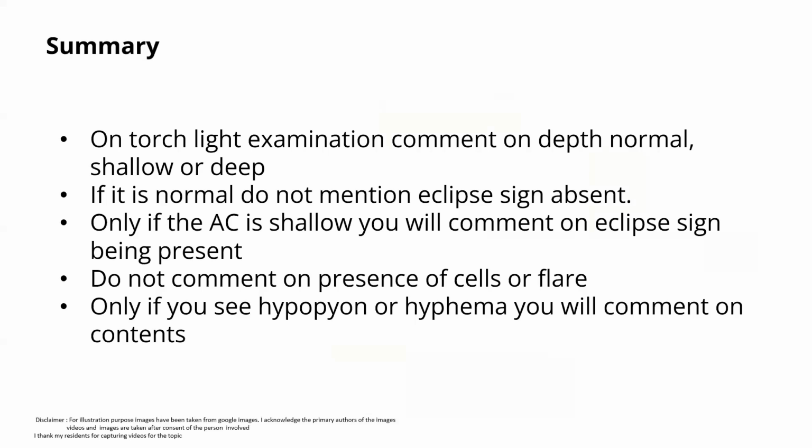Most of the students are in the habit of saying normal depth and no eclipse sign, no hypopyon, no hyphema. So you don't have to talk about negative findings in the examination. Whatever you see, you comment, but don't comment about things that you're not seeing.